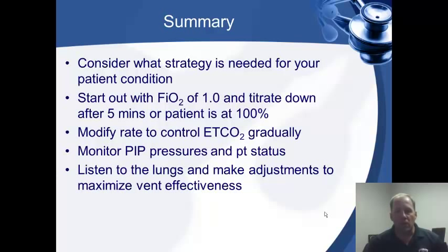Don't forget to listen to the lungs. Just because they're ventilated and you've got a monitor that monitors CO2 and SpO2 and all these great things, you've got to listen to your patients. So make sure you listen to their lungs. Make sure they have good bilateral breath sounds and you don't have any problems there. If they're still wheezing, continue to give them albuterol and Atrovent through inline breathing treatments so that you can maximize your vent effectiveness and start making your patient better quicker.